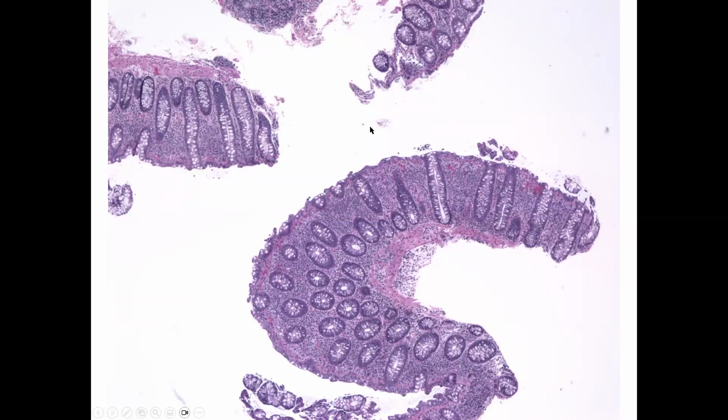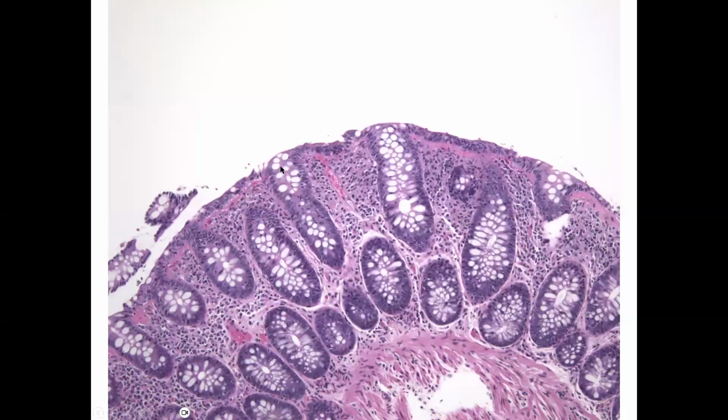So next up is an example where we have increased cells within the lamina propria. Instead of being demarcated like a normal lymphoid aggregate, we're seeing the entire lamina propria filling up with too many chronic inflammatory cells. So something seems to be going wrong here. Let's take a look on higher power. One of the things I notice is that the surface epithelium is kind of indistinct. It almost looks squashed down. It's hard to appreciate the surface epithelium.